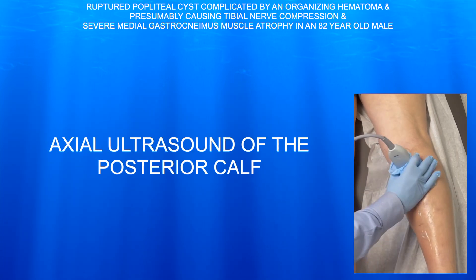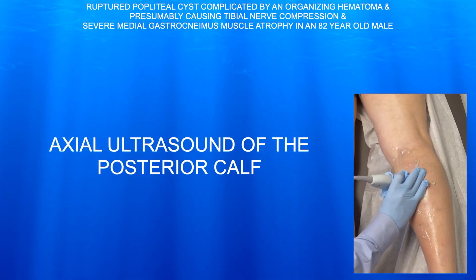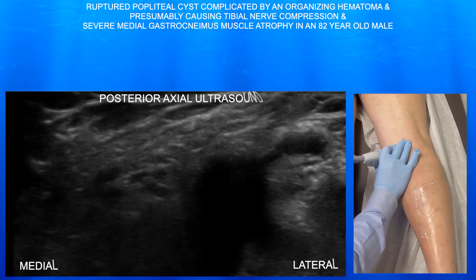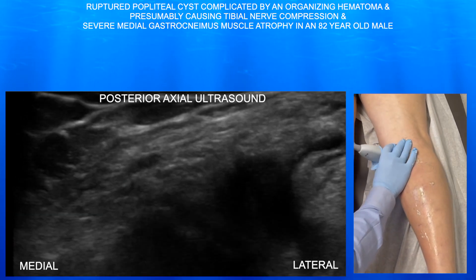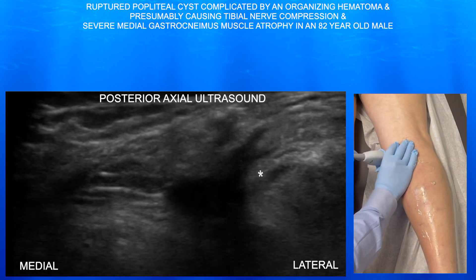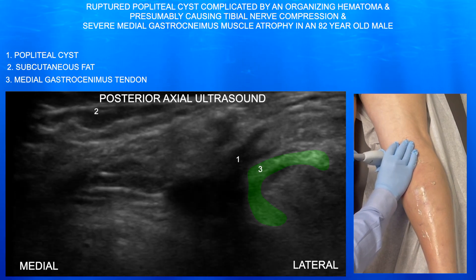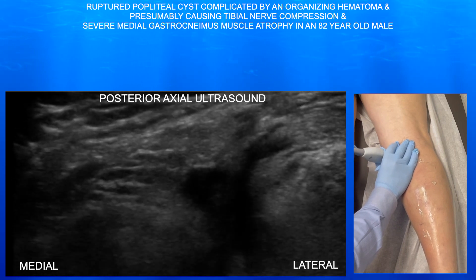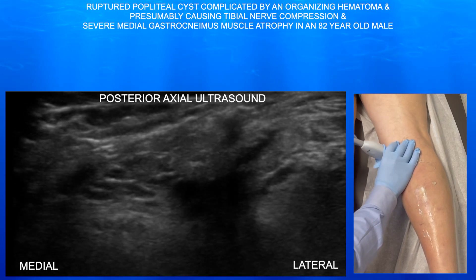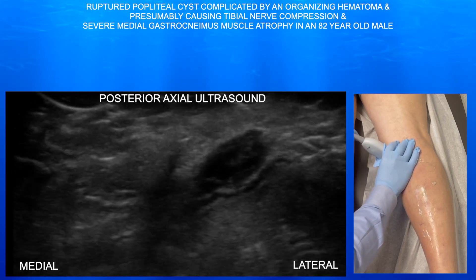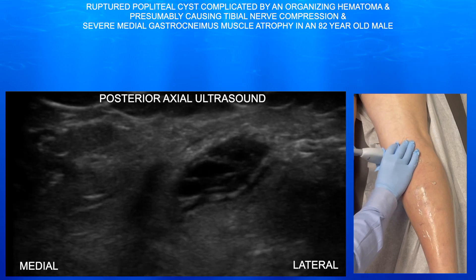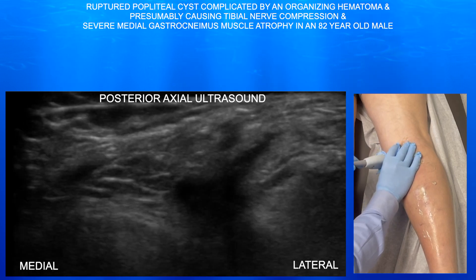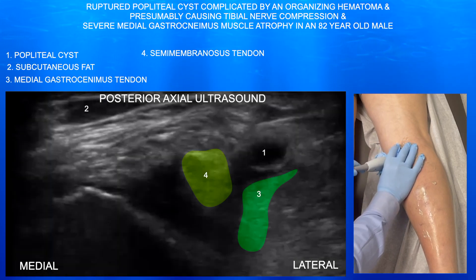Here we're going to look at the cyst in an axial plane. You can see the medial gastrocnemius tendon to the right, and that's essentially like a boomerang-type shape. You don't see the semimembranosus tendon here secondary to anisotropy. Here you can see the cyst going in and out of view, again with some organization and hyperechoic stranding within that cyst.